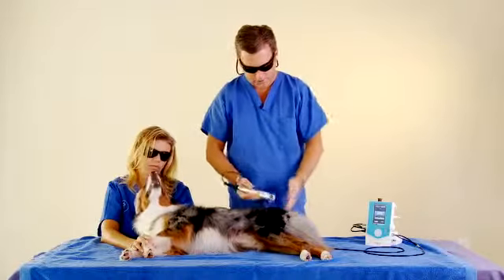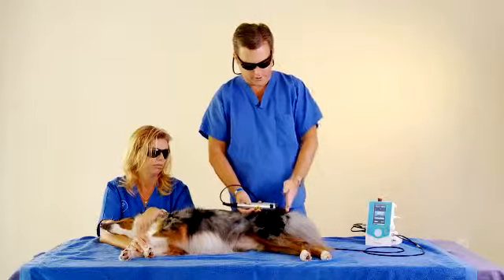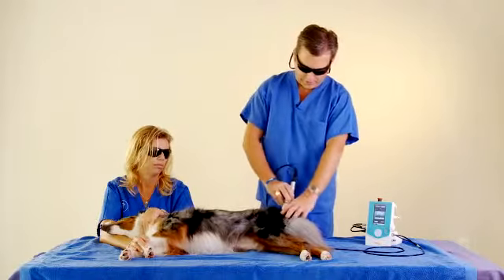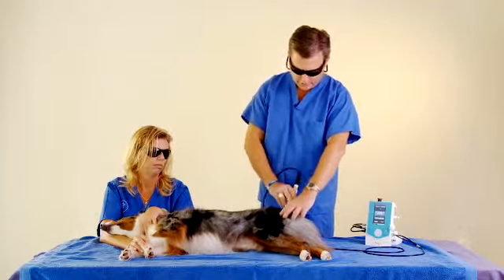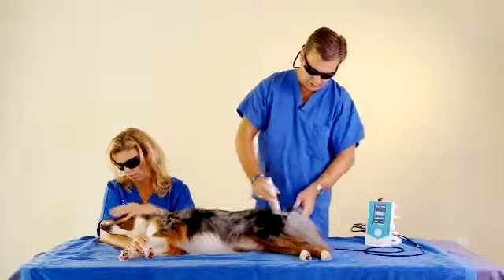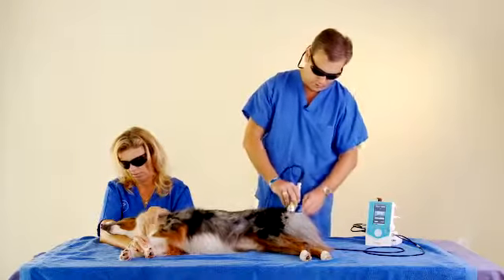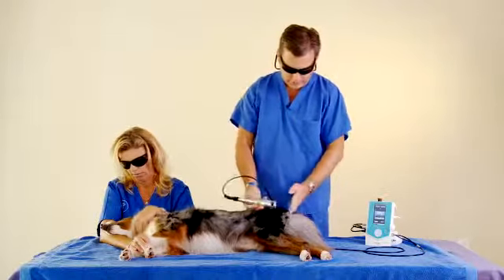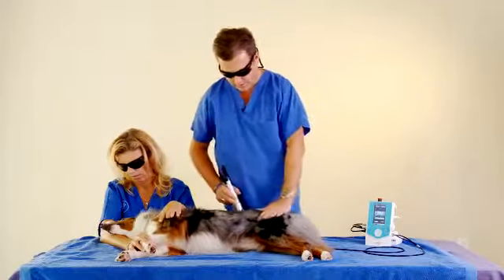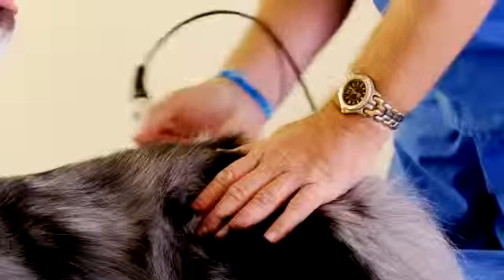You want to think of the laser as 2 to 2.5 inches out from your standoff. That's your working depth. So again, with your clinical judgment and knowing the anatomy of your patient, you know where you need to get to. Depending on where you need to get to, you can do this if it's arthritic, you can paint, you can do a spot technique. The whole idea is to get that 2.5 inches of that laser cylinder down to the area that's injured or is arthritic. For degenerative backs, you're only going to be able to get to it one way.